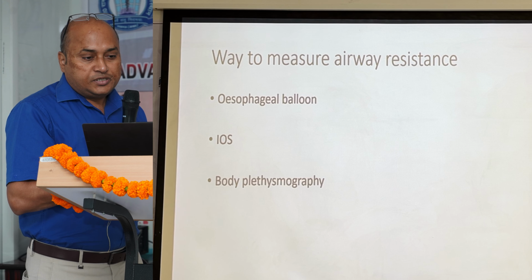Ways to measure the airway resistance. What are the techniques? How do we measure the airway resistance? These are the esophageal balloon, impulse oscillometry, and body plethysmography. There are three ways we measure the airway resistance. And we require to measure the airway resistance in a suspected case of obstructive airway disease.